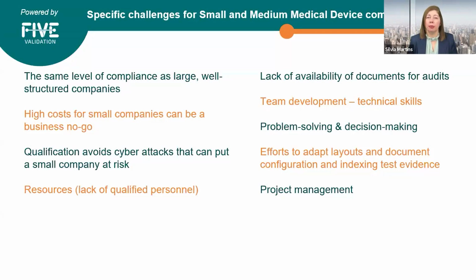Qualification avoids cyber attacks that can put a small company at risk. Proper qualification can help mitigate cybersecurity risks. Lack of qualified personnel: smaller companies often struggle with a shortage of skilled staff. Lack of availability of documents for audits: difficulty accessing the necessary documentation, to have everything ready for audits.